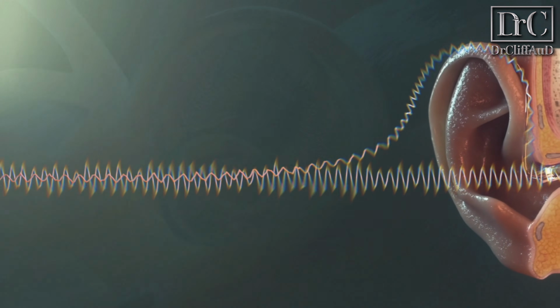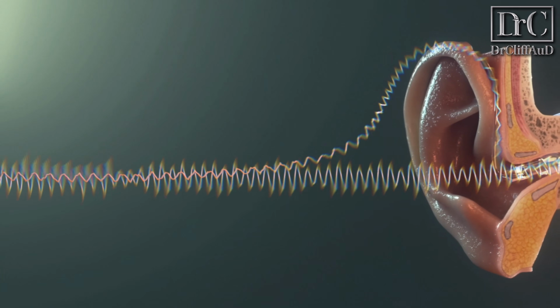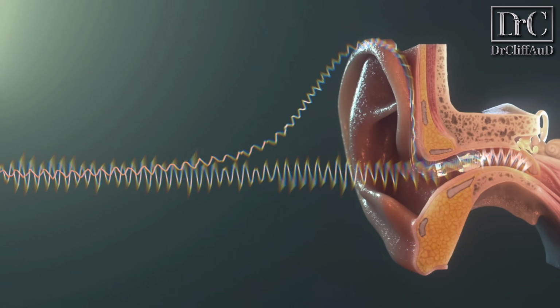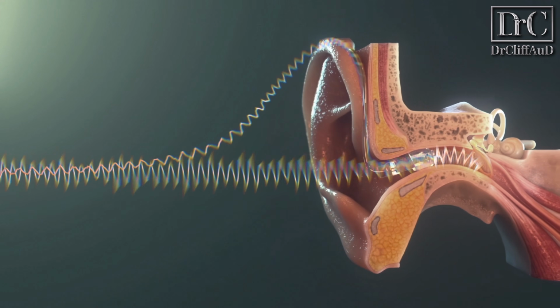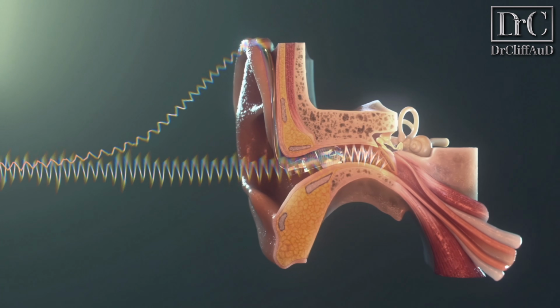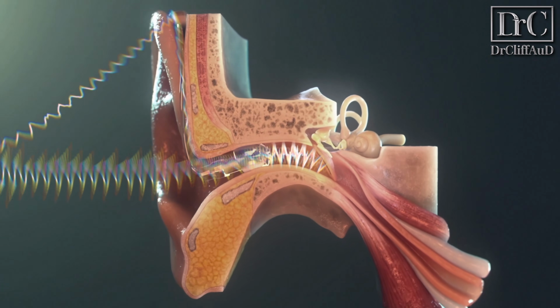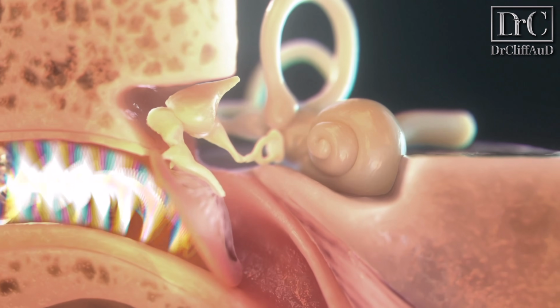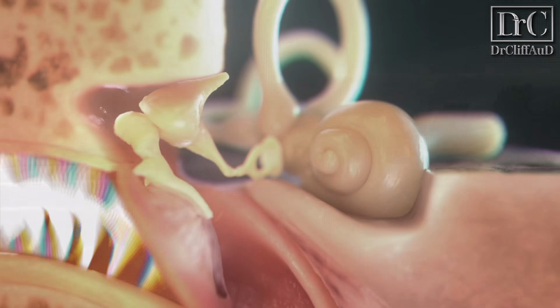Hearing aids help by externally amplifying sound at the precise frequency ranges where an individual has hearing loss. This amplified sound combines with natural sound entering the ear canal, which increases the vibration of the tympanic membrane. This enhanced vibration travels through the ossicles and enters the cochlea.